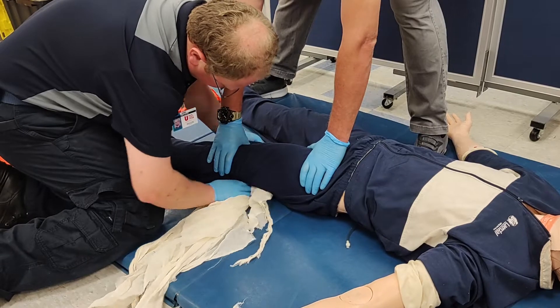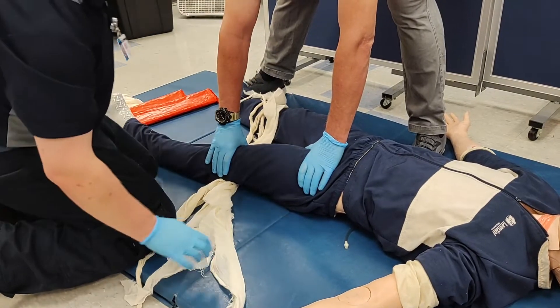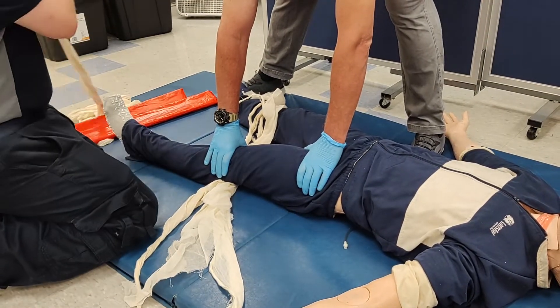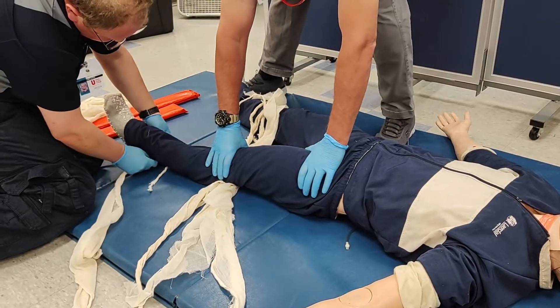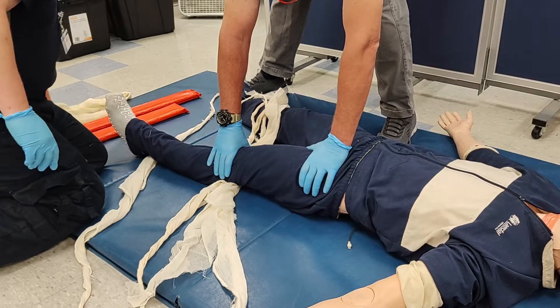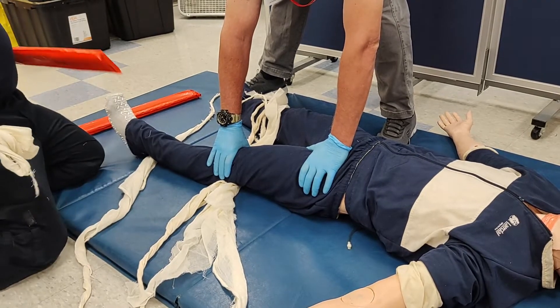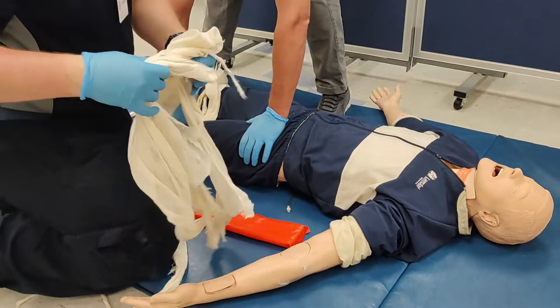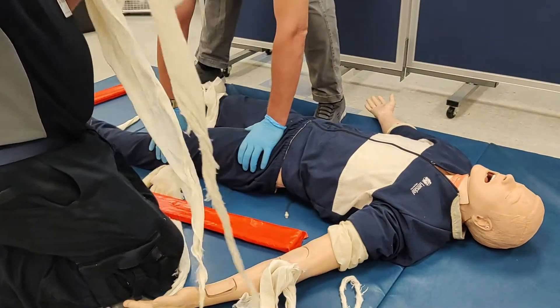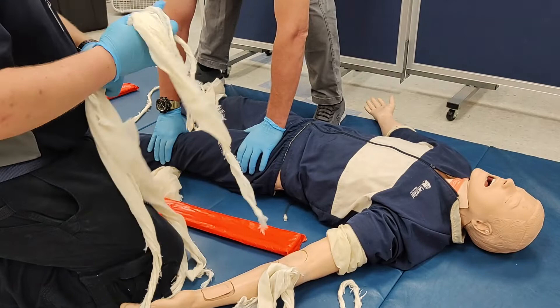At least three cravats will be passed underneath the knee to the area medial to the injury. One will be passed underneath the Achilles, and the final two will be passed underneath the small of the patient's back, underneath their lumbar spine.